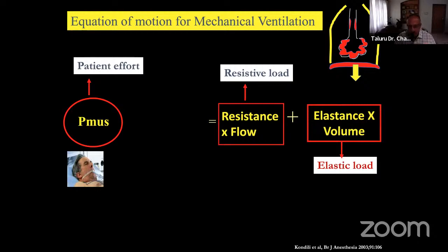There may be both a position change and a lung pathology. It is very difficult to distinguish, but most of the time, once you see a rise in the plateau pressure, look at the difference between the PIP and the plateau. If it is more, it is the airway component. If it is not, it has to be between the alveoli and the chest wall. The chest wall contribution is mostly by clinical deduction. Whenever it is presumed to be from the chest wall, you can apply more pressure. You can apply more PEEP, about 10 to 12 in an obese lady, or with a posture change, you can go up and do repeated recruitment maneuvers.